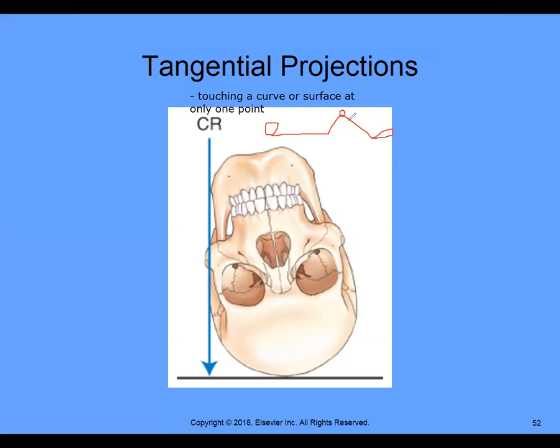In order for me to take an x-ray of that patella bone, because we need to rule out a fracture or whatever it may be, I need to perform what we call a tangential projection. I'm going to position the patient similar to this, what I've drawn. My x-ray tube will be over here. Okay, this is my x-ray tube.